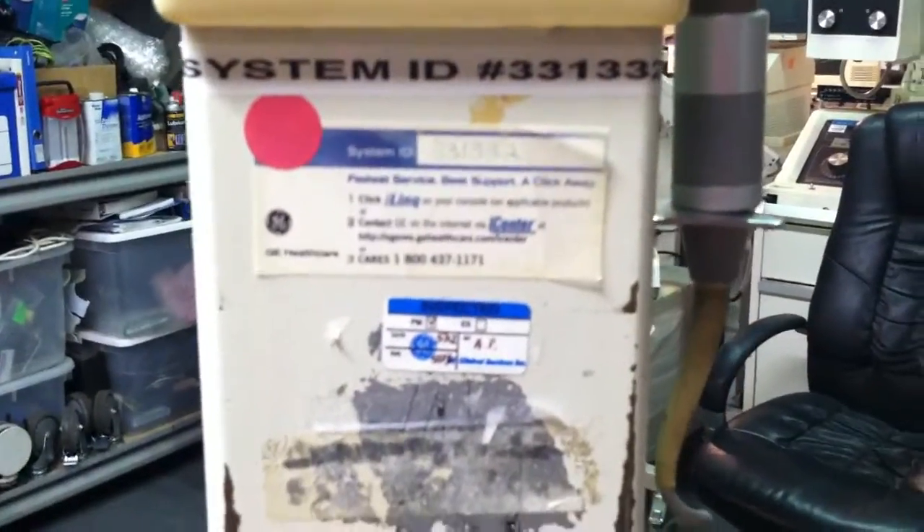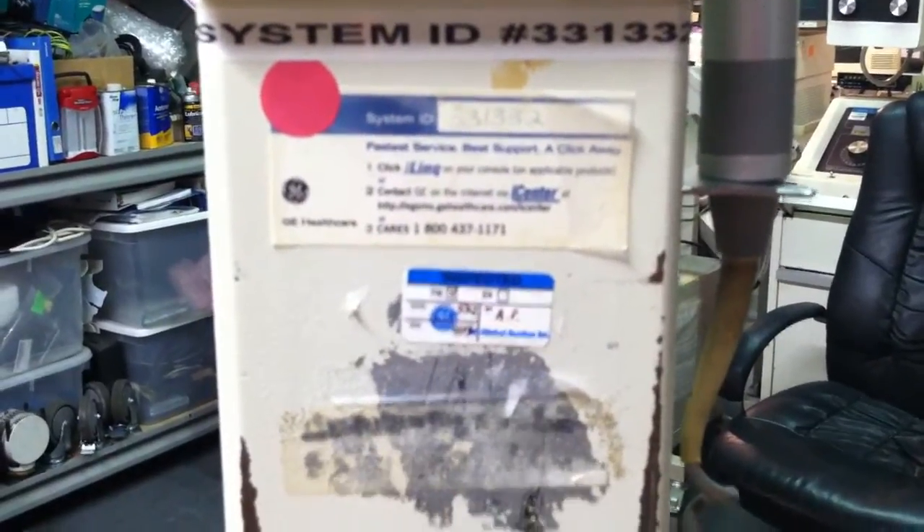This is the system ID — this is where the machine came from. From a hospital, far from us.